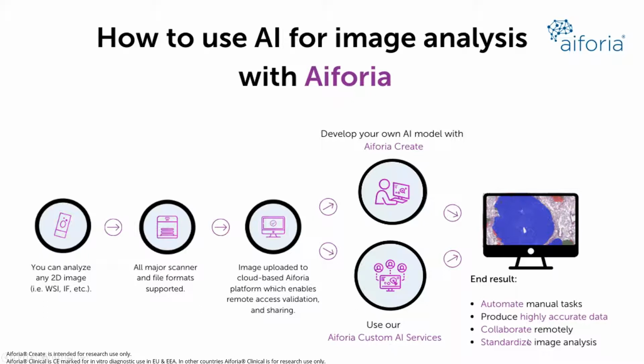So what's really nice is that neural nets do not get tired. They are highly accurate. So you can automate these manual tasks that take up a lot of human time. And this really allows you to standardize your image analysis, go much more quickly than you would have been able to do before. And again, it's really nice that you can collaborate remotely. You don't have to physically be face-to-face with someone, especially now with the global pandemic. Fingers crossed for the vaccine availability soon.